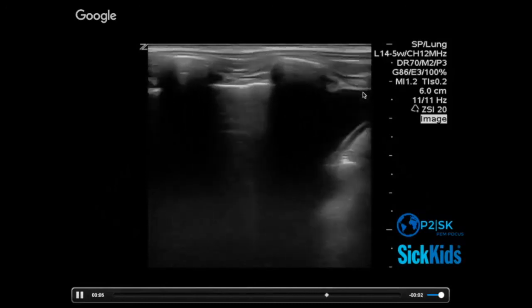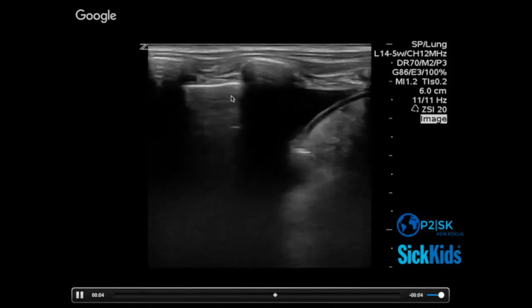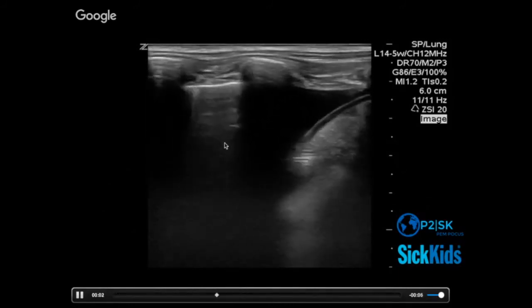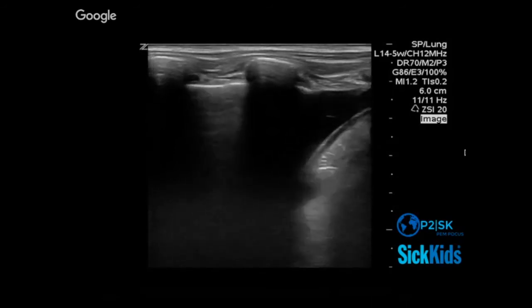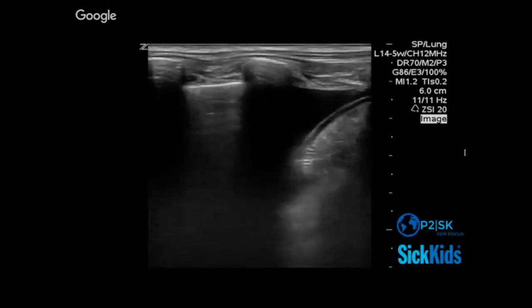Yeah. I would probably anticipate that this kid would have what you see here, which is they do have a number of B lines. You'll see them more near the end of the clip. A little shower of B lines shows up there. So not the kind of thing we see every day, and probably not important that we go, this is dengue hemorrhagic shock syndrome, which is what it was. But that we use that principle of when do I divert from fluids to pressors based on what I'm seeing in my ultrasound.